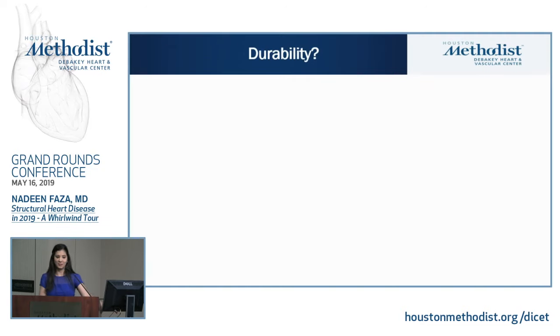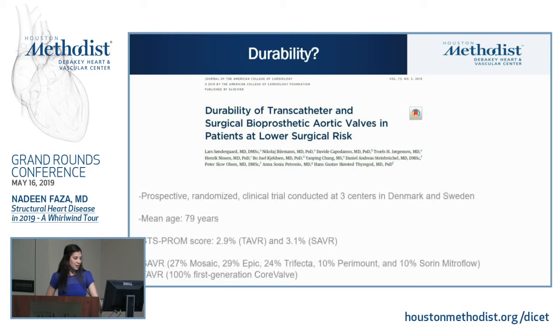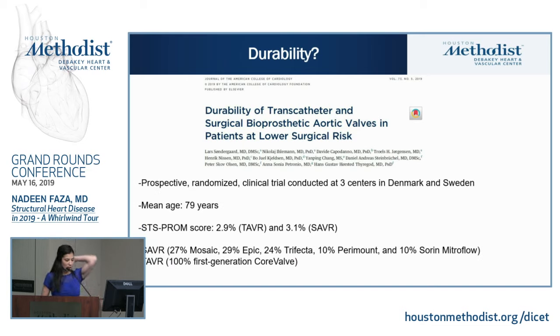How about durability? This paper was also published as part of the NOTION trial, studying the durability of transcatheter versus surgical bioprosthesis in patients at a low surgical risk. This was a prospective randomized clinical trial conducted in Europe.